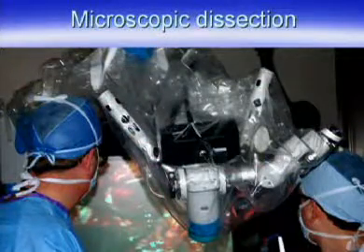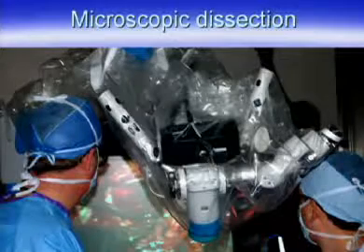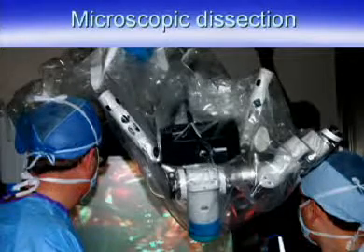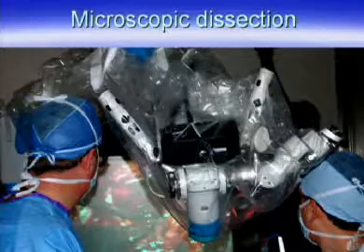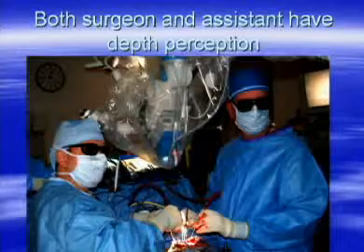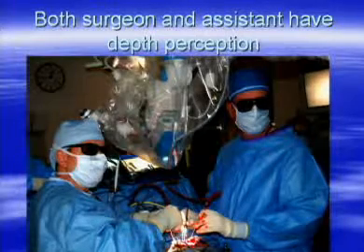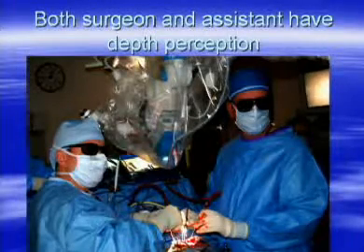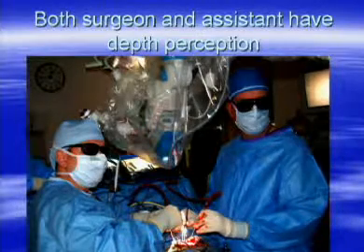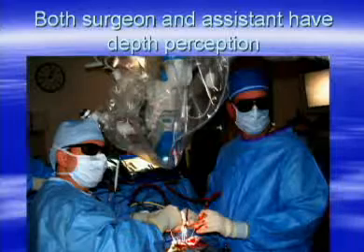The interesting thing is that the microscope was actually suspended above the surgical field, and you'll notice that neither one of us is actually looking through the microscope at this point. The microscope is simply a holder for the camera system. And the benefit of this is that both of us were able to do the operation, to actually operate in real time, both with stereoscopic vision, basically unimpeded.